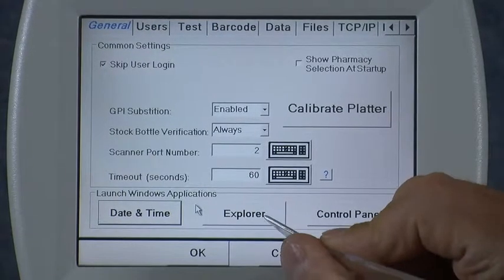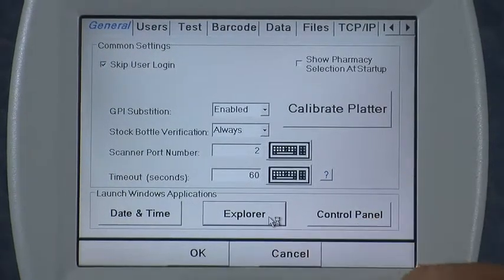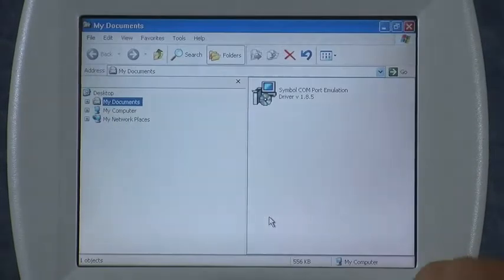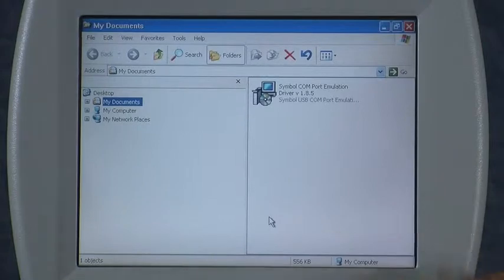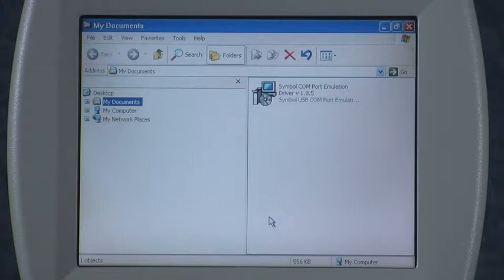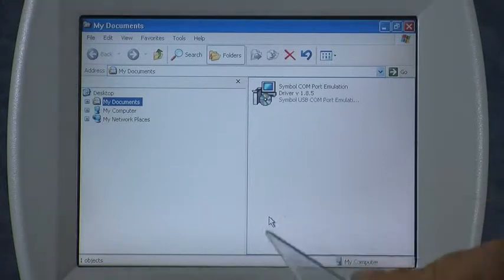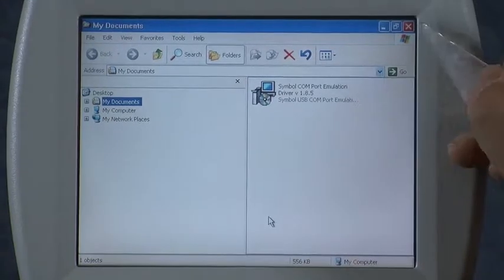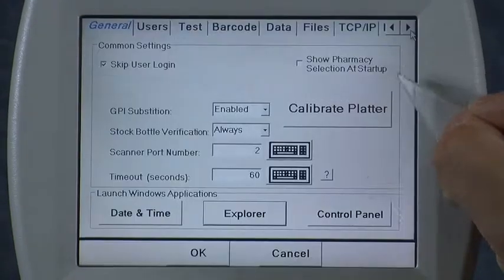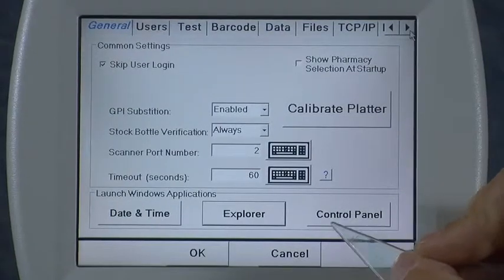Next, Explore — you should never have to go into here. Typically, if we have you try to do something special on your icon while you're calling the factory for technical support, you may have to go into this menu. Same with Control Panel.